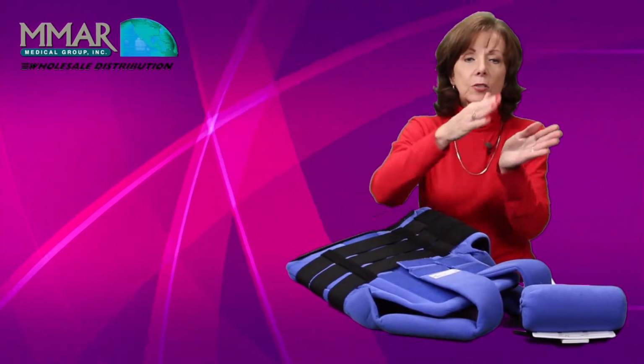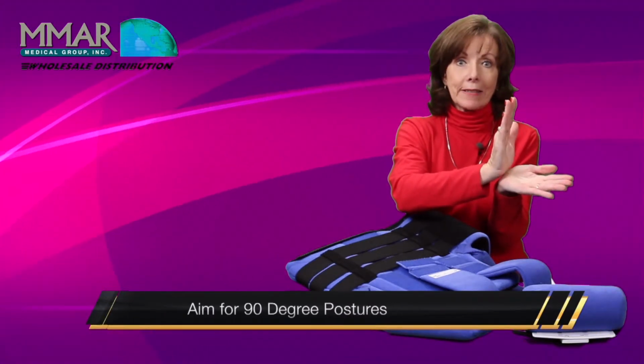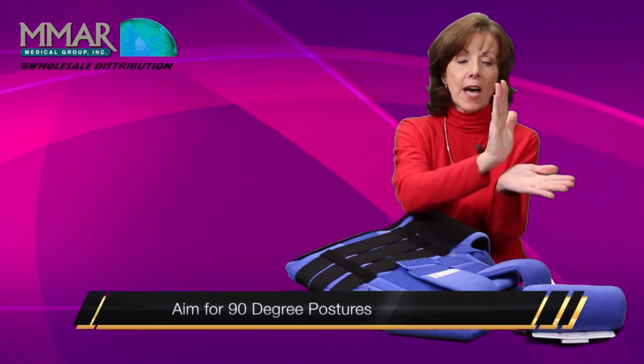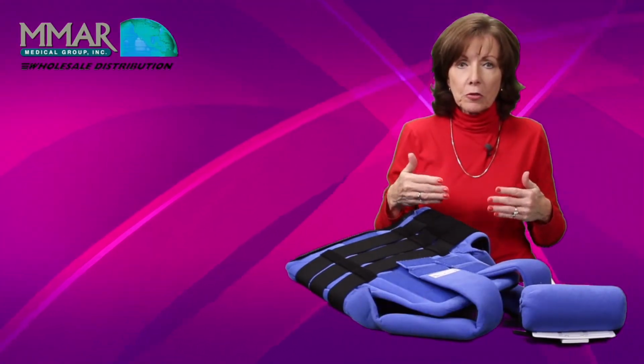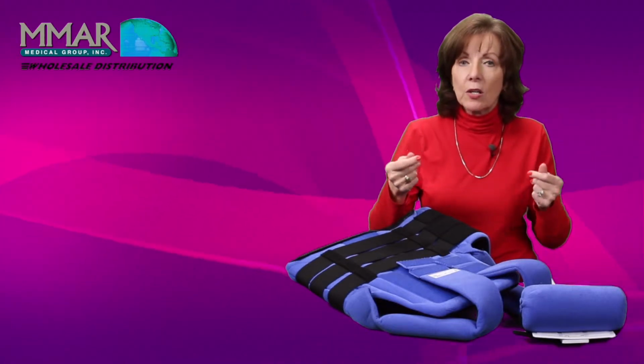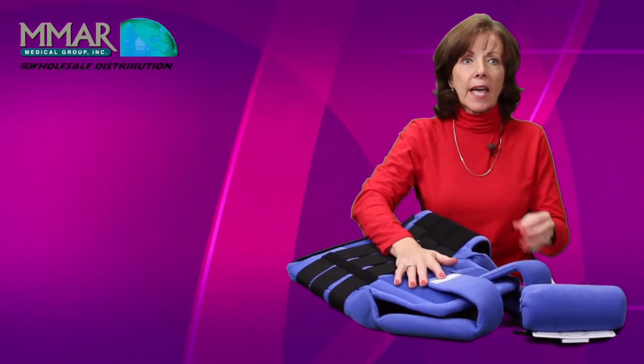What we need is good 90-degree pelvic tilt. You want 90 degrees at the hip. Here's your back, here are your thighs, and we want them at 90 degrees, maybe even a little forward. That will break that tone and you'll see them relax. These are people that have trouble getting words out, getting complete sentences out. They can be confused.